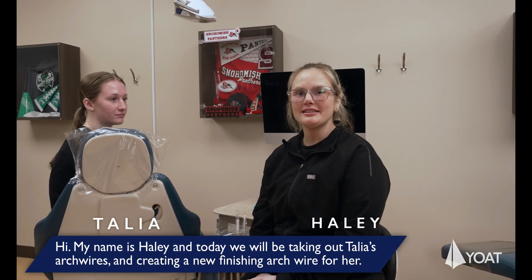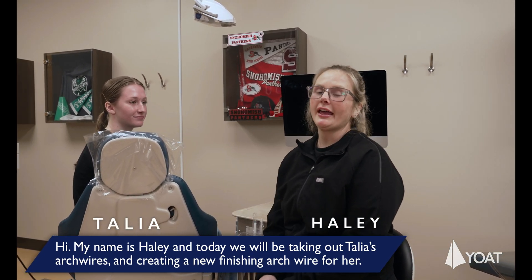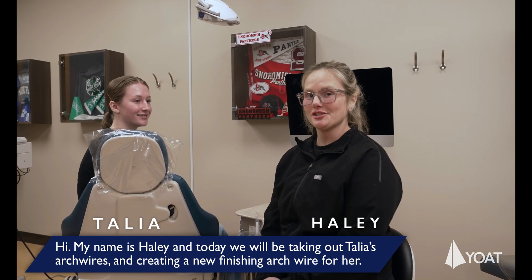Hi, my name is Haley, and today we will be taking out Talia's arch wires and creating a new finishing arch wire for her.